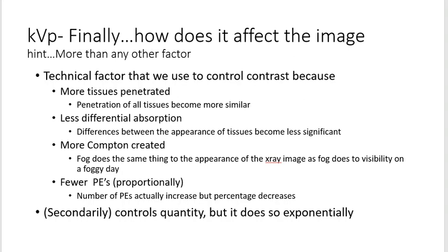We can discuss that in class if that kind of lost you, and I can play with some numbers on the board and hopefully make that better understandable. But you need to understand as kVp goes up, all interactions inside of the patient go up. The reason we say that photoelectrics go down is because we get such an increase in Comptons that it appears that the photoelectrics go down.